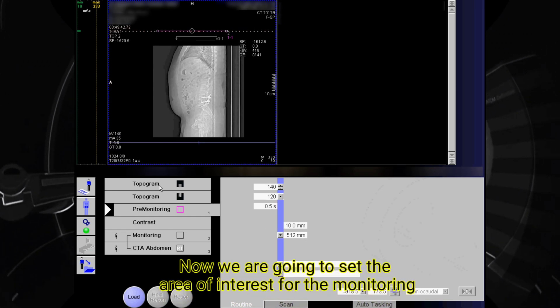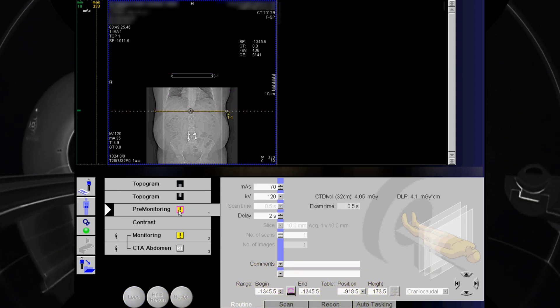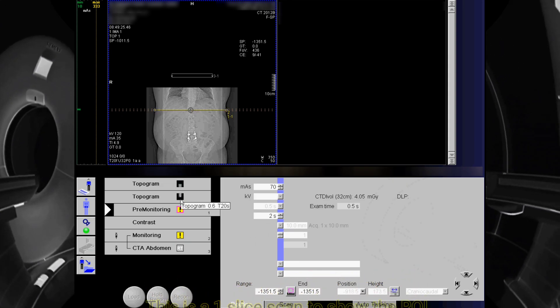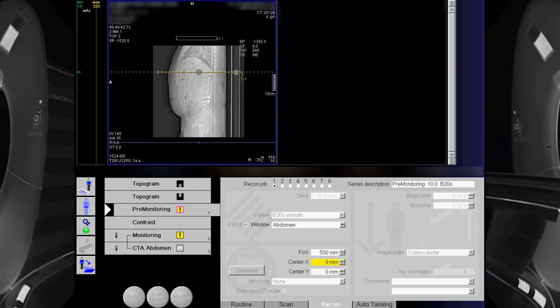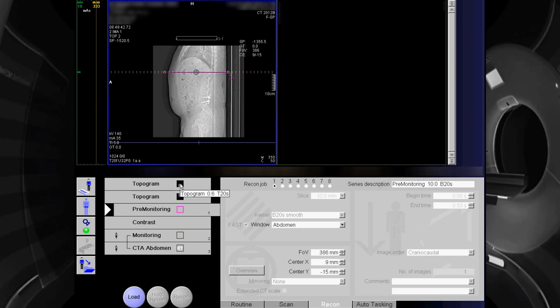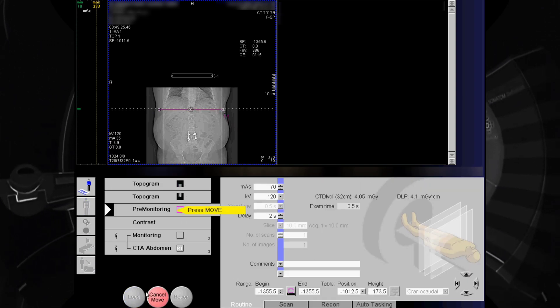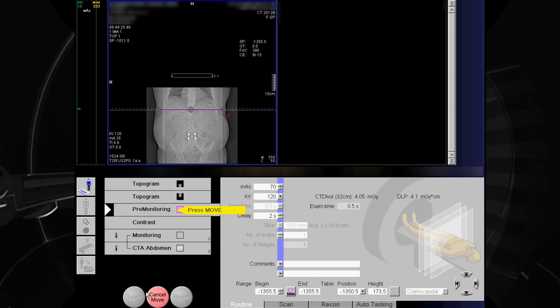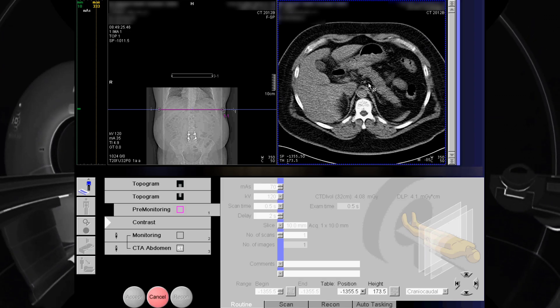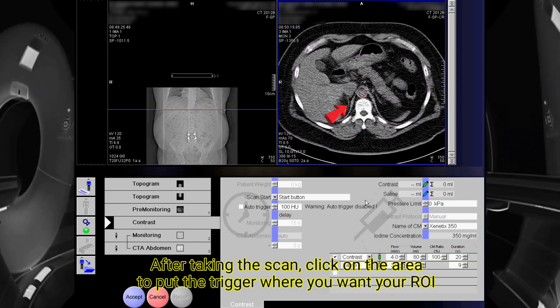Now we are going to set the area of interest for the monitoring. This is a one-slice scan to show the ROI. After taking the scan, click on the area to put the trigger where you want your ROI.